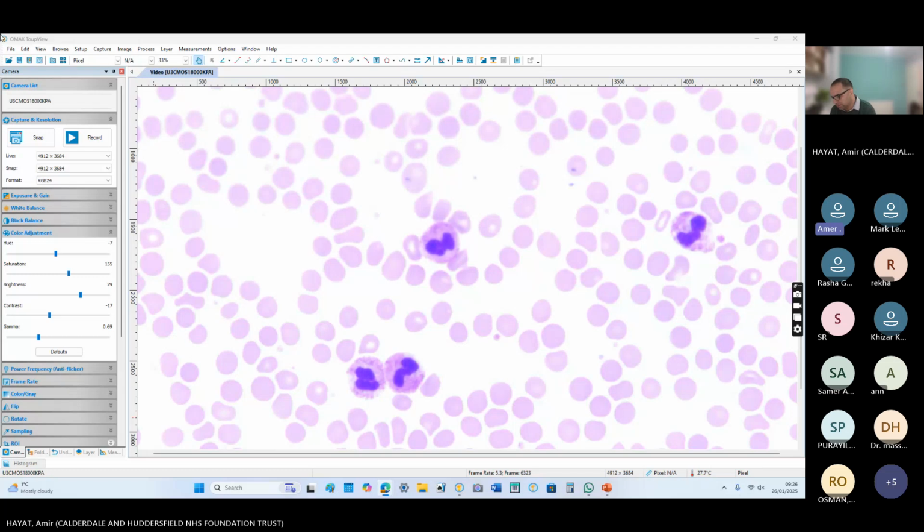Okay. And if you have a transplant unit in your patient, you can see the blood film of normal people with GCSF. But if not, you may have a lymphoma patient or myeloma patient in your units. When they receive GCSF, you can check their blood film to differentiate it from CML and sepsis-induced leukemoid reaction. In sepsis-induced leukemoid reaction, you may see a lot of NRBC as well, because bone marrow is very much under stress.